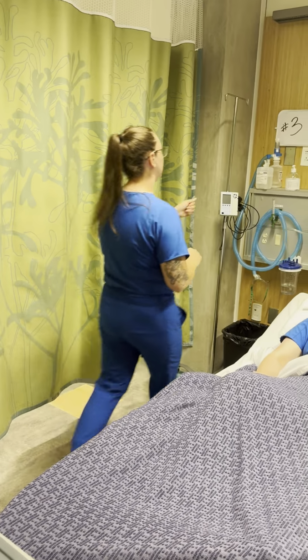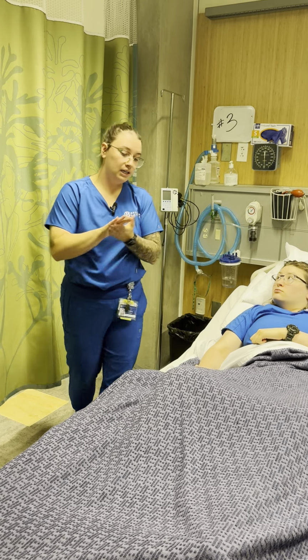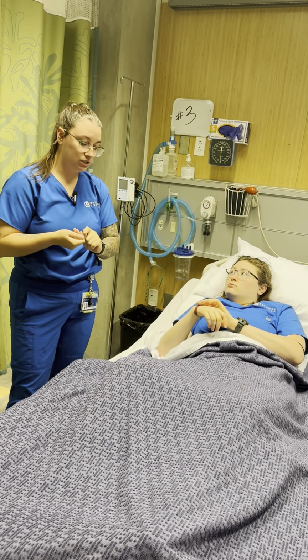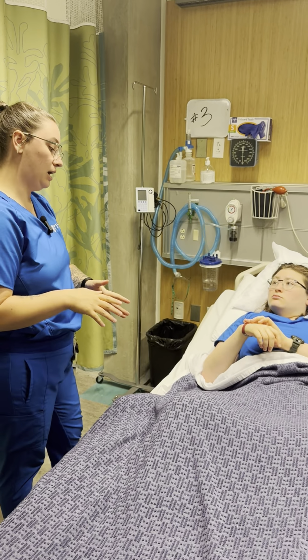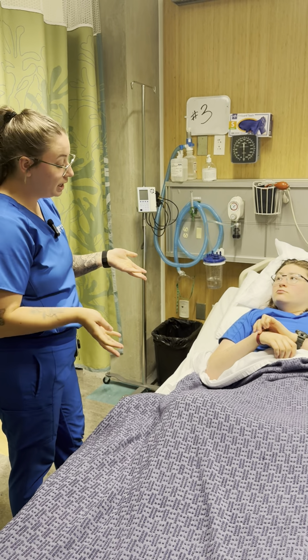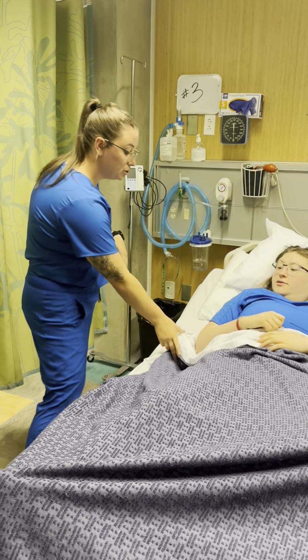We're going to perform hand hygiene. Okay, so I can give the IM injection, which is ketorolac, in 3 different locations. I can do deltoid, I can do vastus lateralis, or I can do the ventrogluteal area. Which would you prefer? I prefer the deltoid. Okay, just for education purposes, I will demonstrate the other 2.